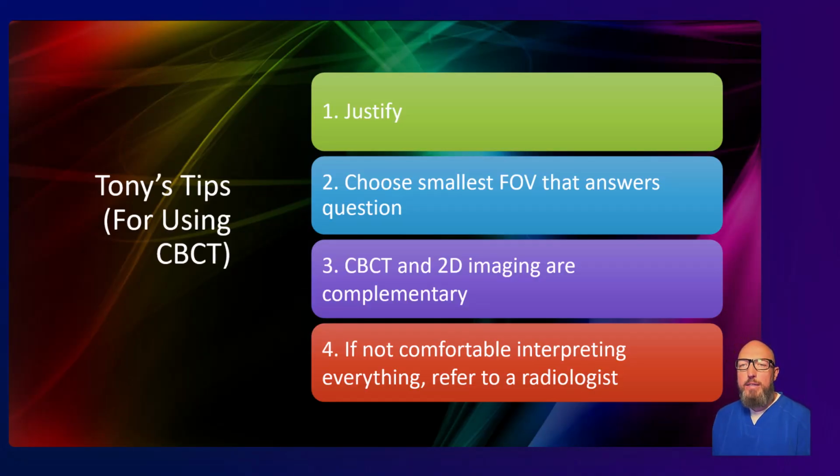And here are my practical tips for a general dentist thinking about using CBCT. Tip 1, justify before you order. Write down and have in your mind a specific clinical question that the scan is answering, usually that can't be answered in 2D imaging. So if you can't articulate one, you don't need the scan. That's kind of the bottom line there.